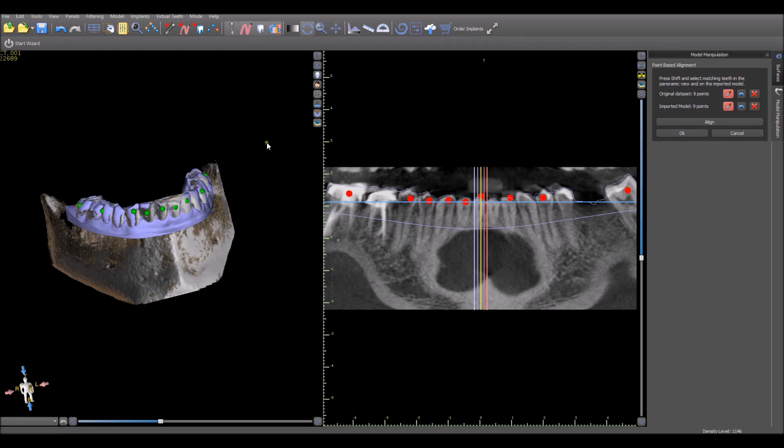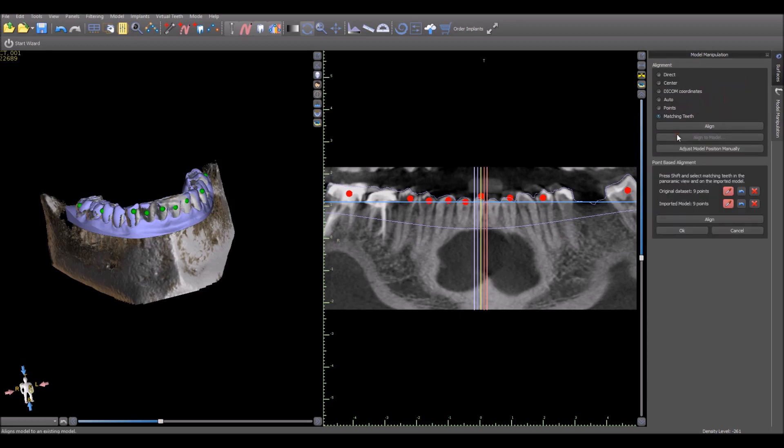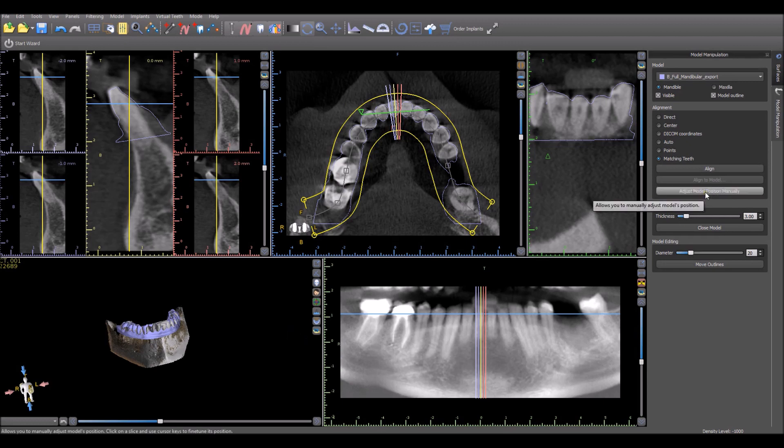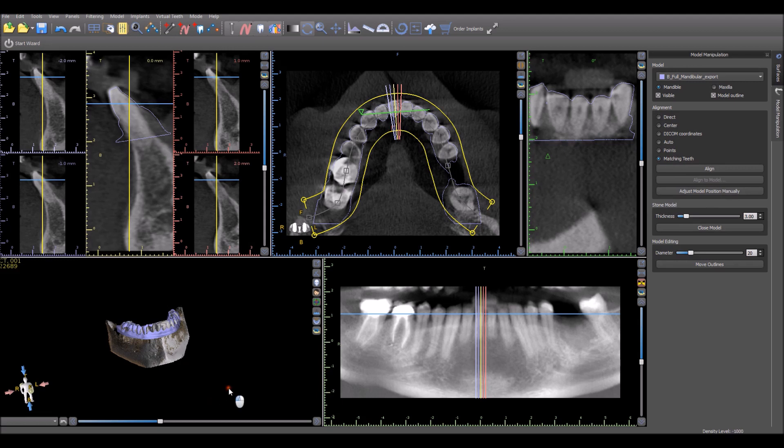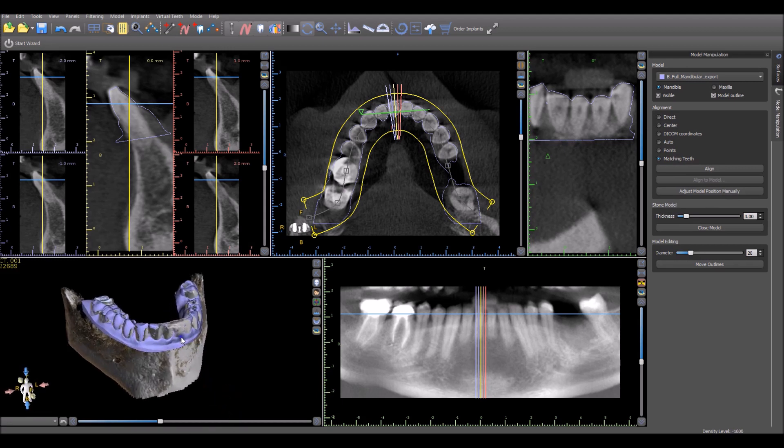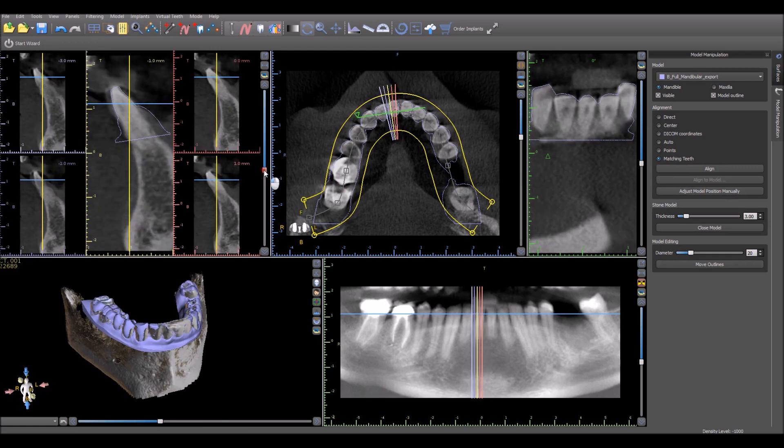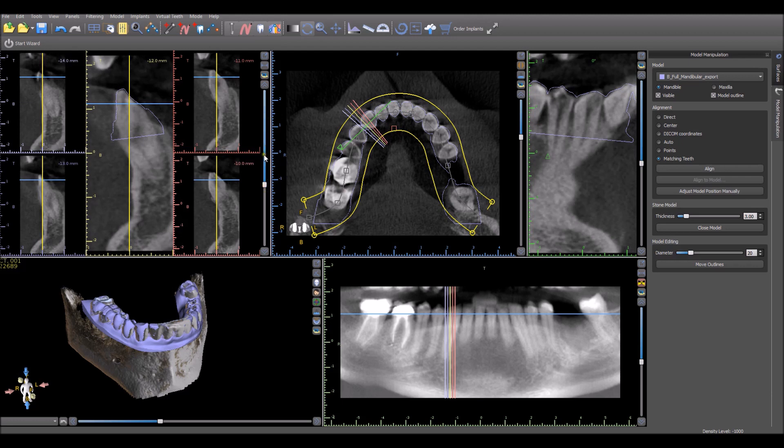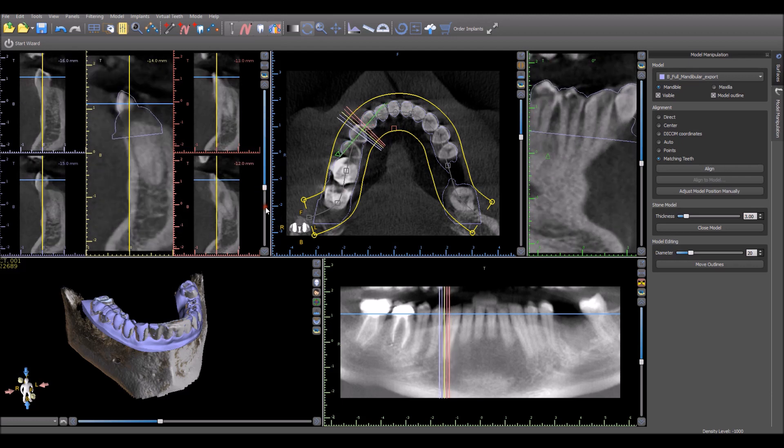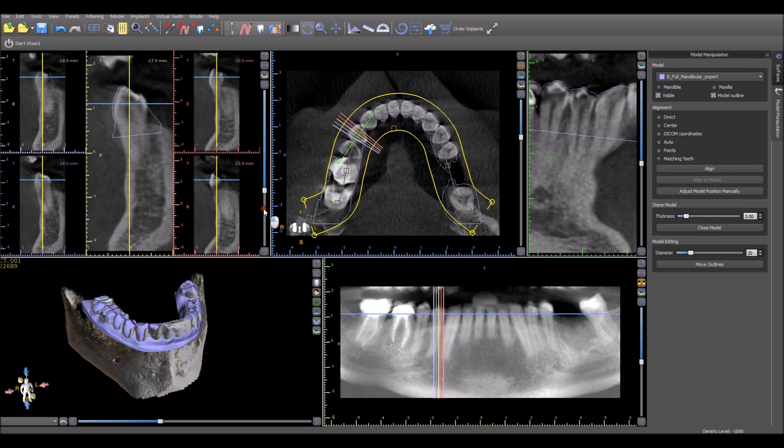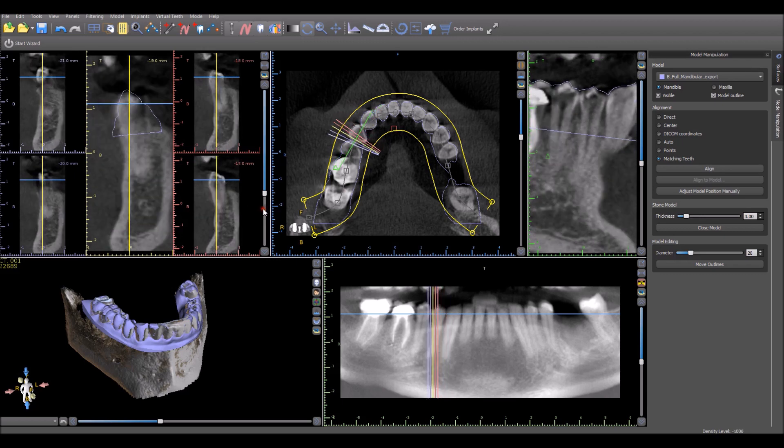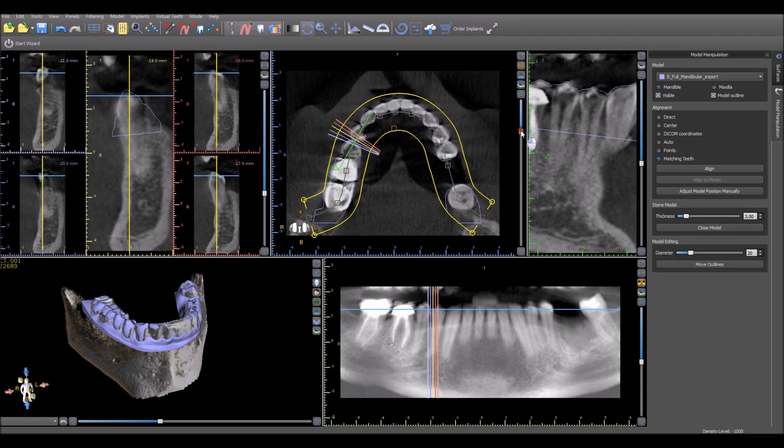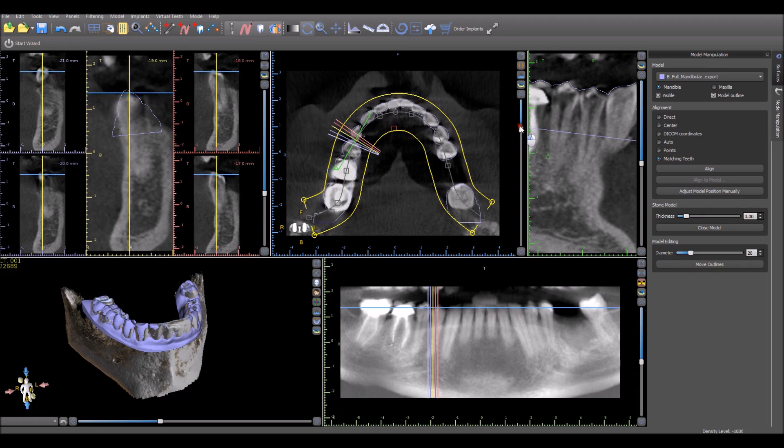Once the merge looks good to us, we could go ahead and press the OK button and it brings us back to the software screen. There are additional functionalities to adjust the position manually or to do other types of merging, but we're not going to get into that at this point. We could look a little bit more in detail at the quality of the merge by running around the arch. We want to look in the areas where there are teeth in the cross-section view. We want to make sure the outline is tightly wrapped around the teeth.